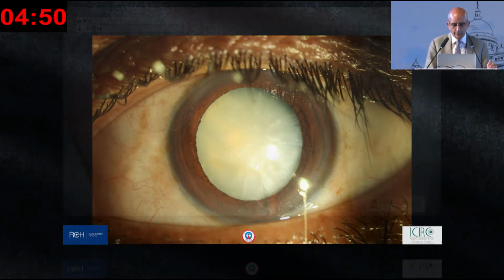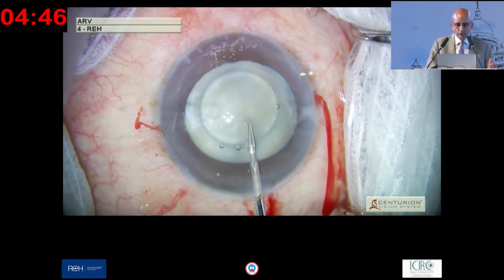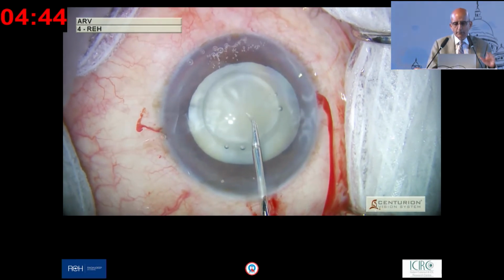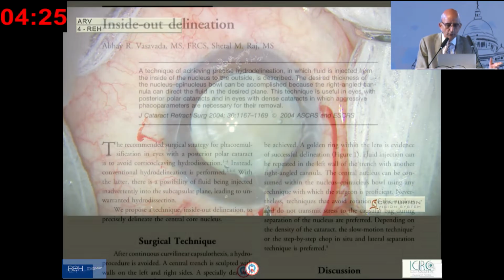You will need it. So this is once again a femto delineation situation, but not delineated because the lens X will not go through the opaque material. So at least we got the right size, and that right size would be 4.8 maximum, because we need that capsule capturing the IOL. So not very big. So with the lens laser technology, we can do that.